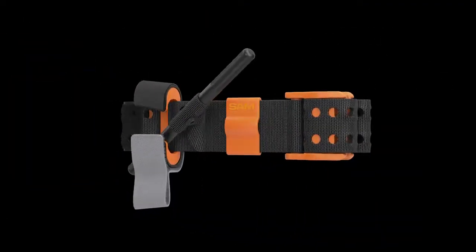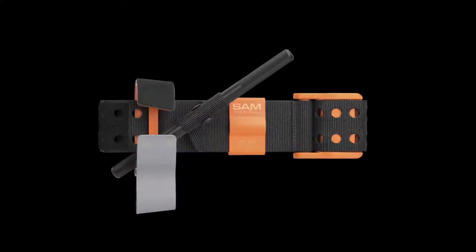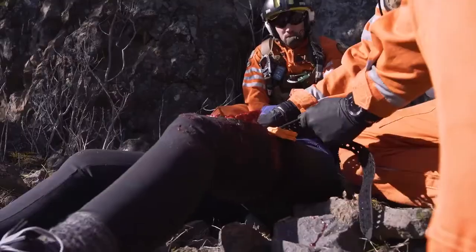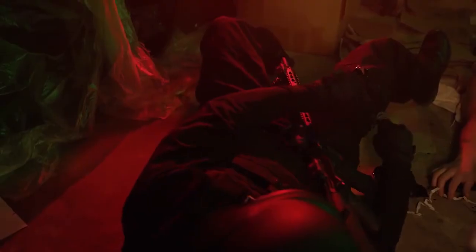This is the Sam XT Extremity Tourniquet by Sam Medical. Upper Extremity Self-Aid.